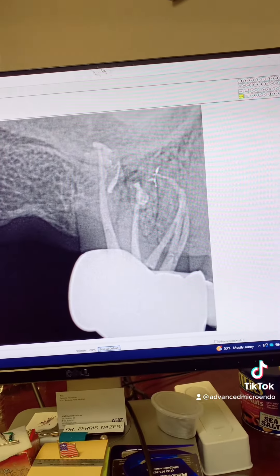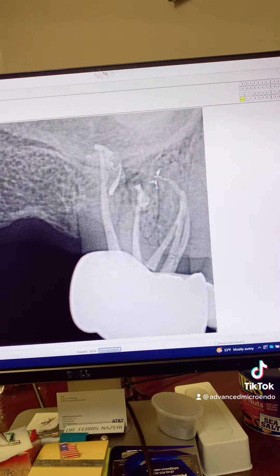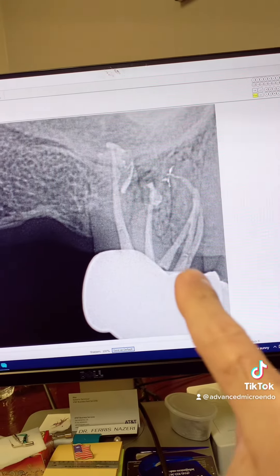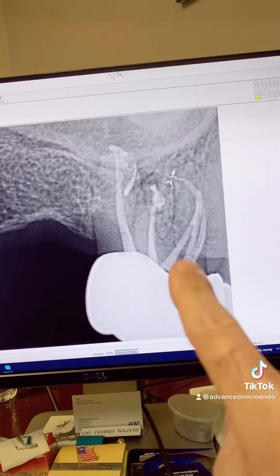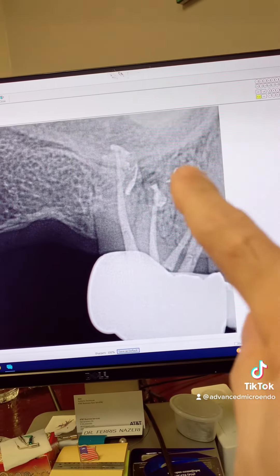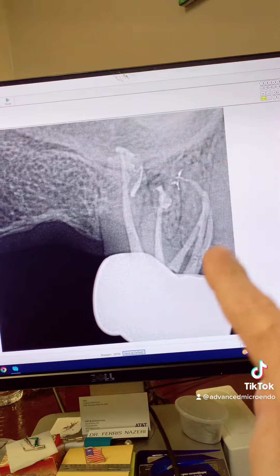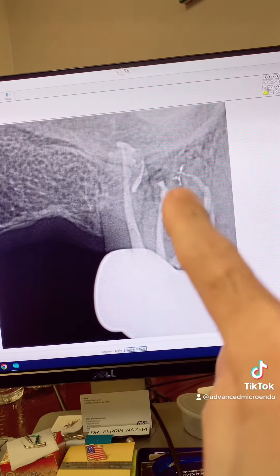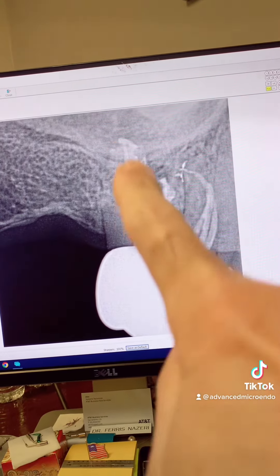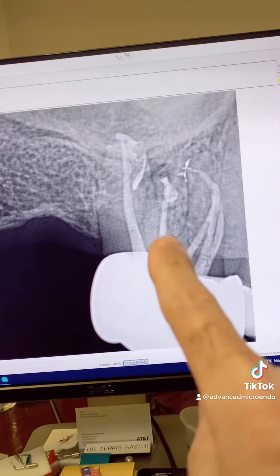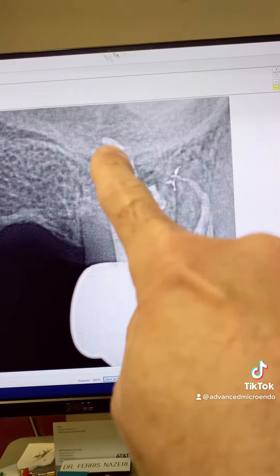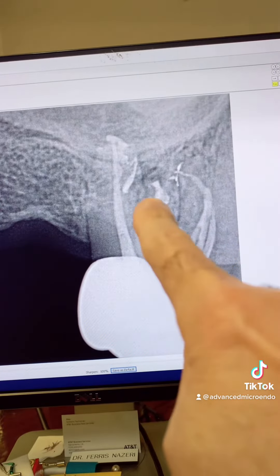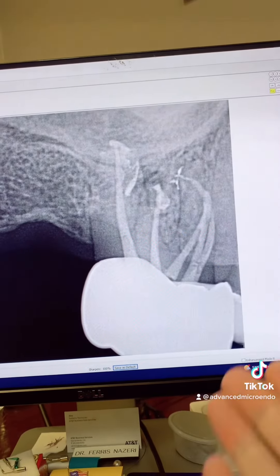Look at this — MB1, MB2, MB3. Look at the curvature of the canals here. Distal buccal and palatal. Look at all of that anatomy there.